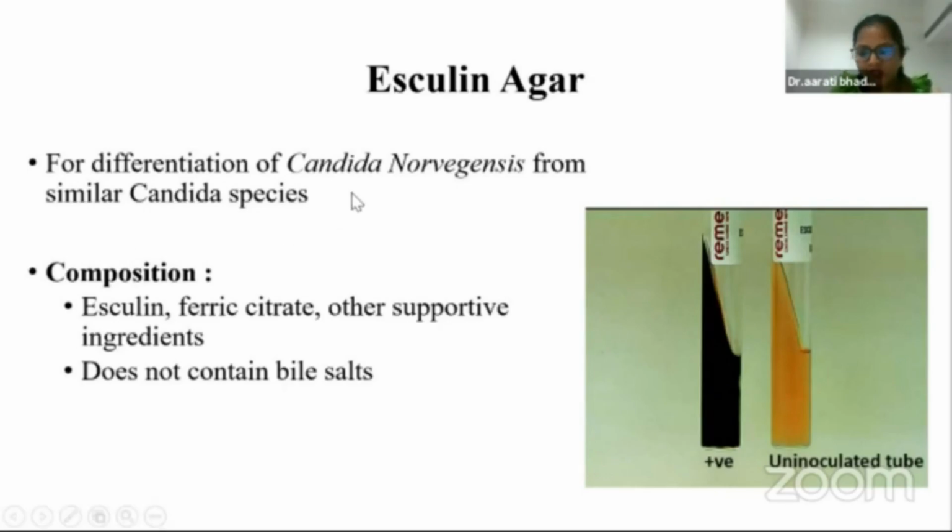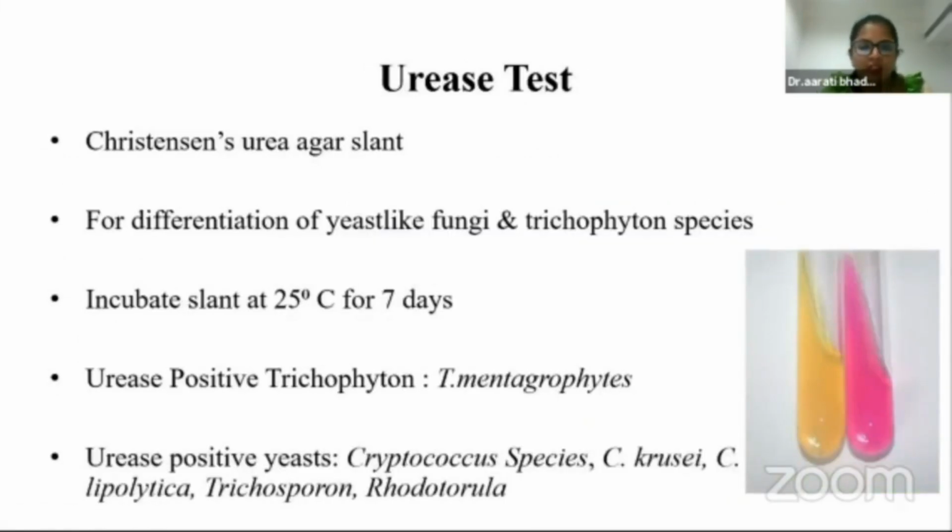So Candida norvegensis will be positive. Next is urease test, which is very commonly used in the laboratory. It is used for the differentiation of yeast-like fungi and Trichophyton species. We have to incubate at 25 degrees Celsius for 7 days.